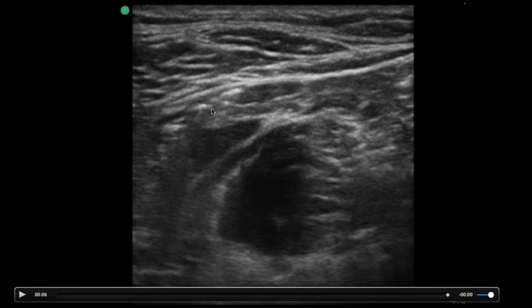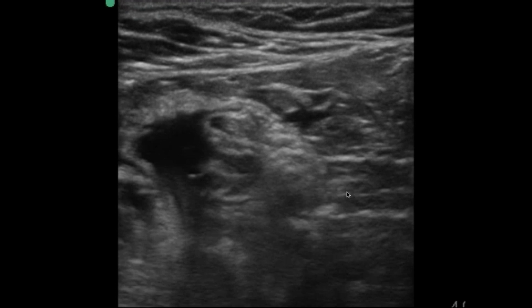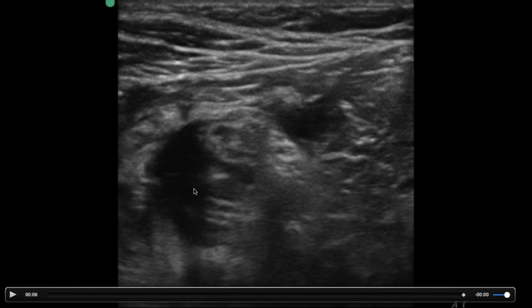Because you're coming in horizontally, you can inject anesthetic that can travel above and below the nerve. And then it's helpful to track up and down here. They're going to track distally and then come back up to see that the anesthetic is fully surrounding the nerve and in that plane that contains the nerve, to get a good indication that this is going to fully block that nerve.